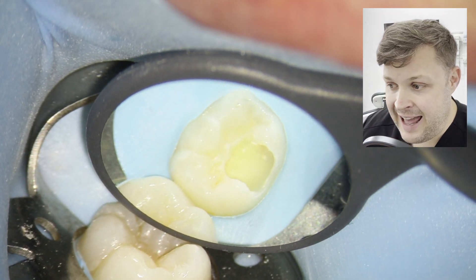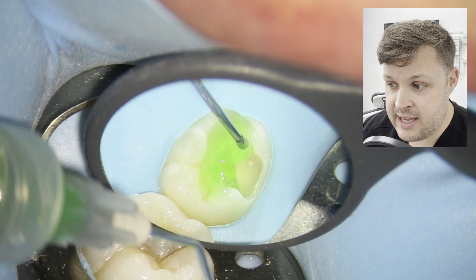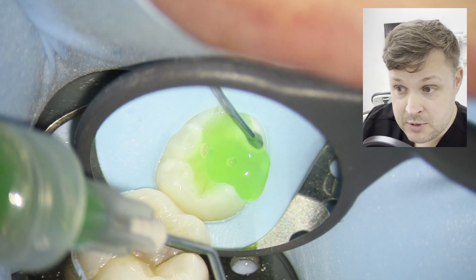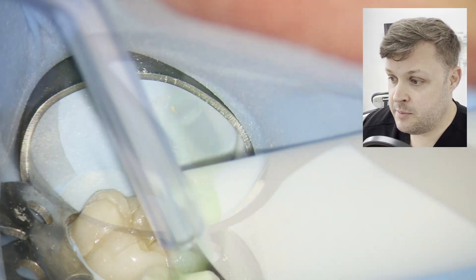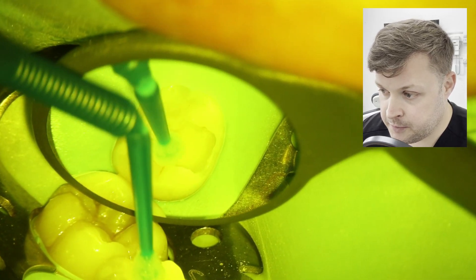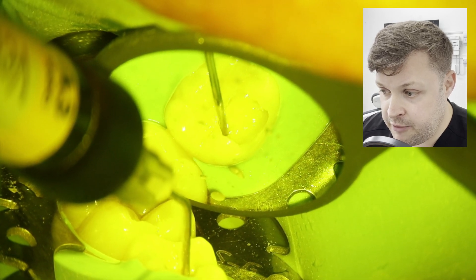I'm using a selective etching technique, placing the etch slightly around the cavity margin and also brushing it into the cavity itself, then washing it away. I'm using I-bond as the bonding agent, followed by a little bit of flowable composite over the top. This filling has quite a lot of layers, but that's to ensure longevity.